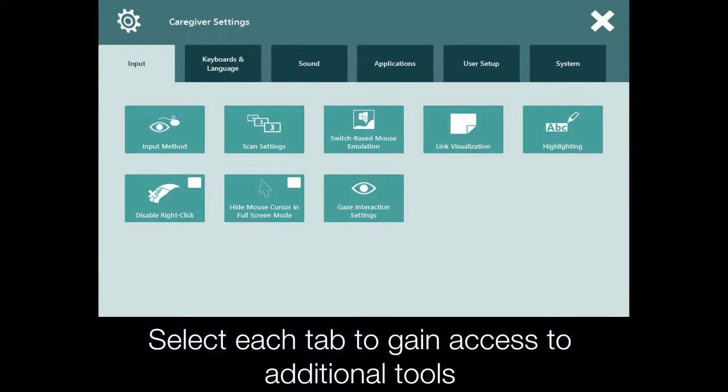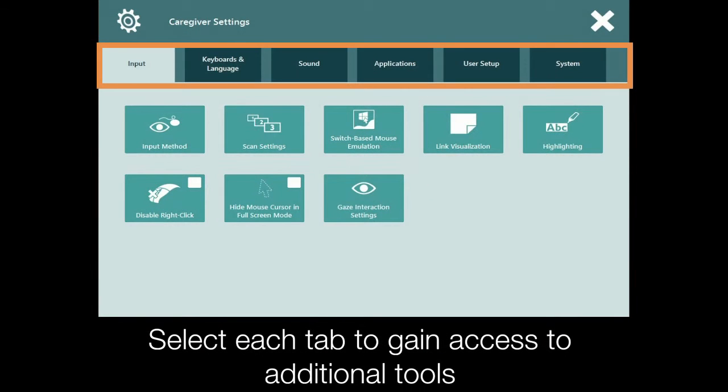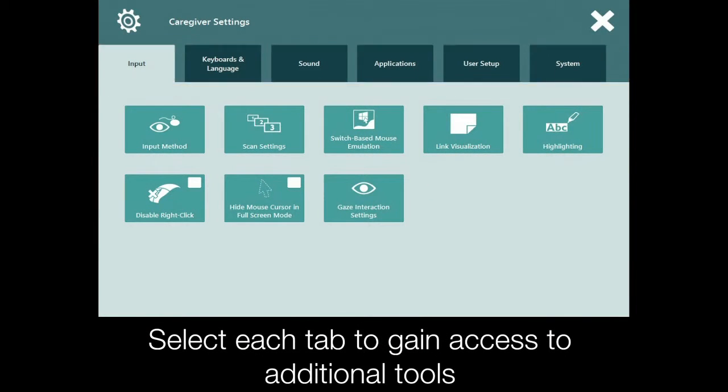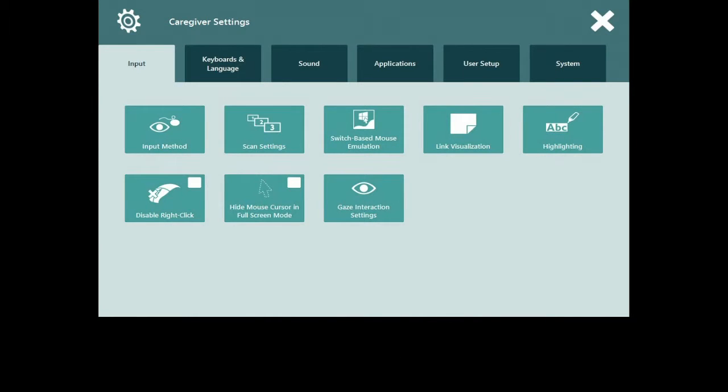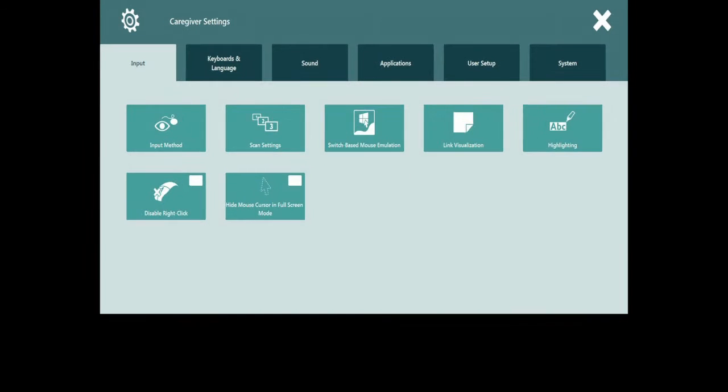The caregiver settings menu contains a series of tabs that when selected present different tools needed to manage the Communicator 5 software. We're going to work our way through all of the tabs and highlight some of the tools.